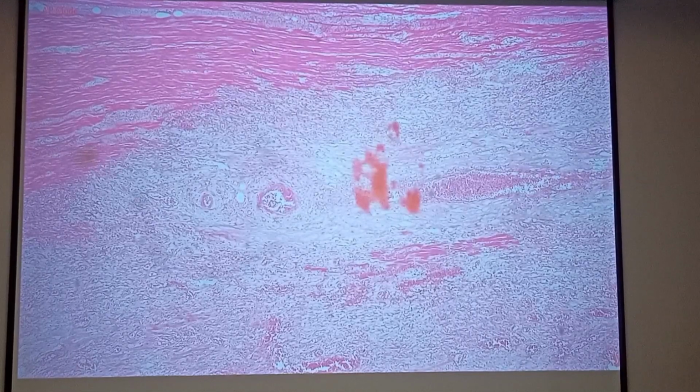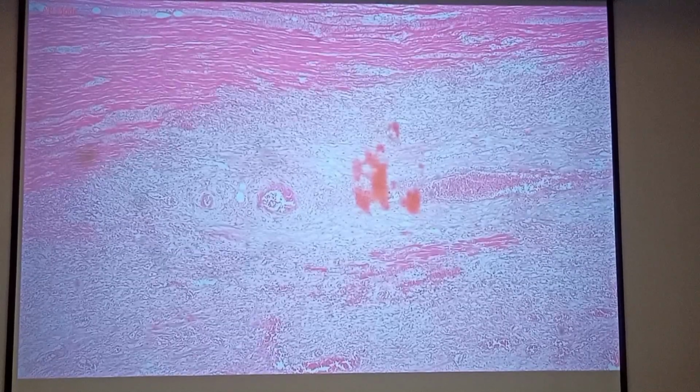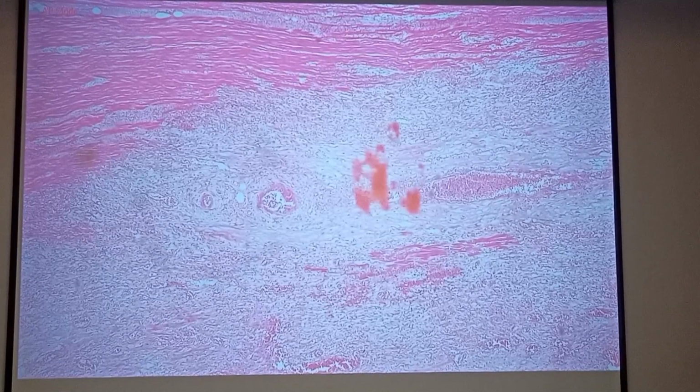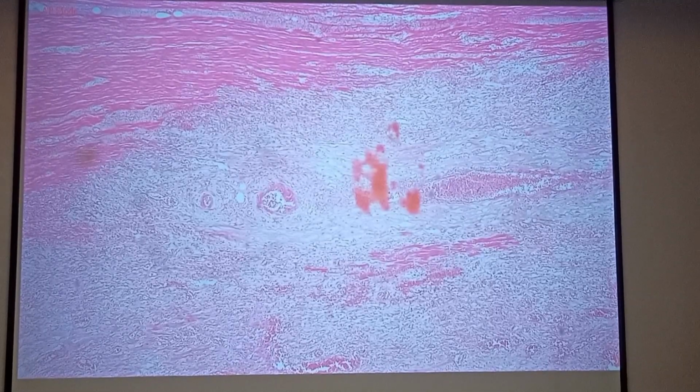And you can see a paler area. Pale pink, pale pink. You can see it was one piece and then it became pale, abruptly. And then, this is actually the necrotic part, the one that underwent the infarct itself.